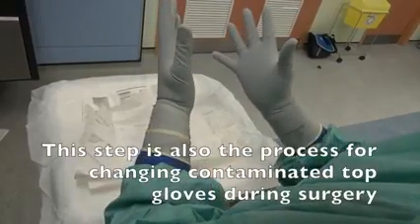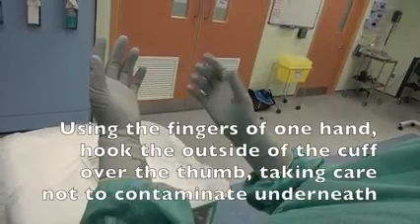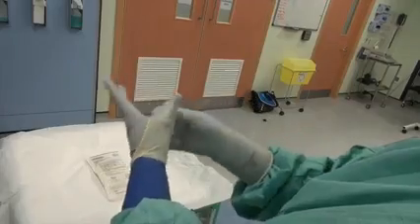This step is also the process for changing contaminated top gloves during surgery. When removing contaminated gloves at the end of surgery, using the fingers of one hand, hook the outside of the cuff over the thumb, taking care not to contaminate underneath.